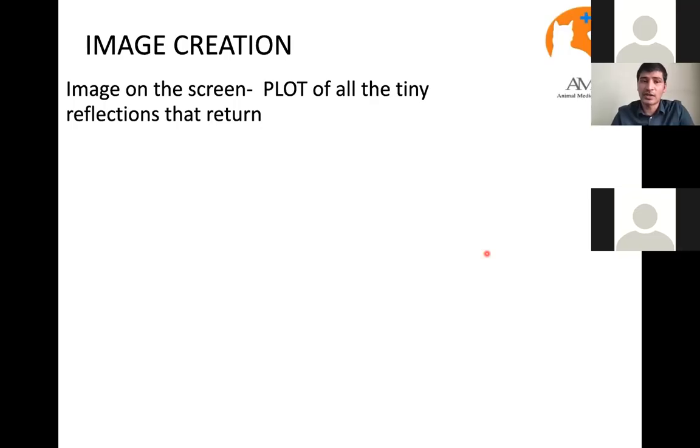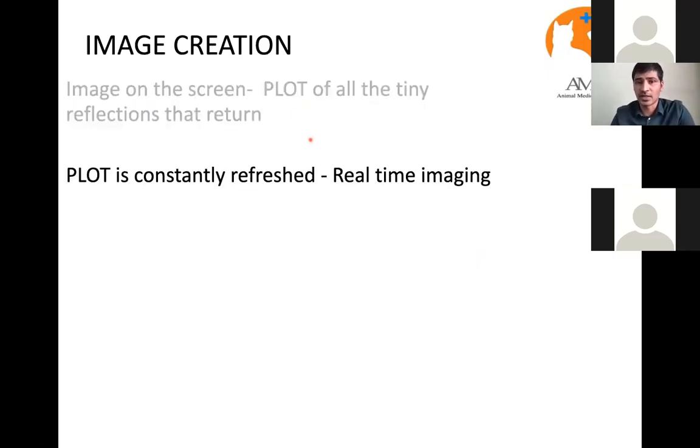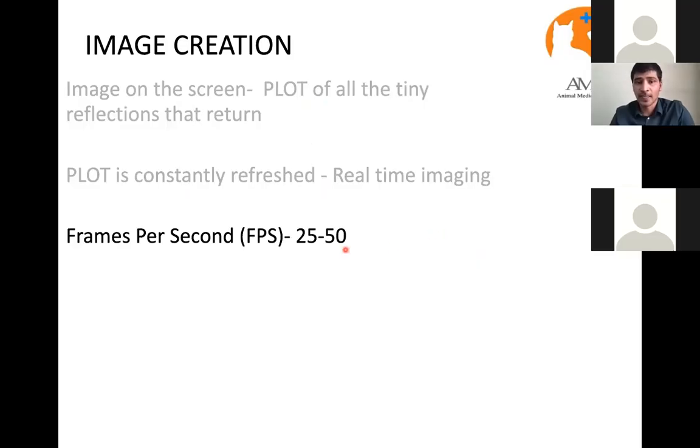The same thing happens in ultrasound. The image on the screen is a plot of all the tiny reflections that return. That means many sound waves leave, and each reflected echo has a specific location on the image where it comes and creates the image. And this plot is constantly refreshed. That's how we get real-time imaging. That's also something we will understand.